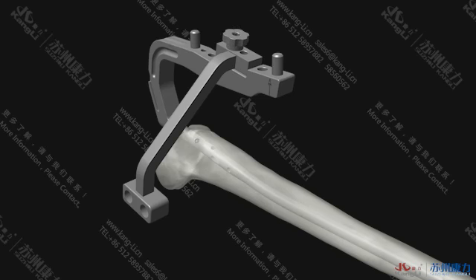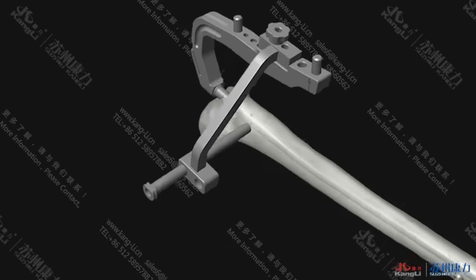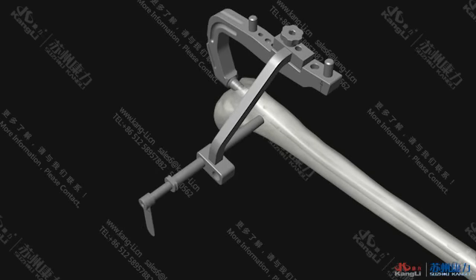Insert the outer sleeve and soft tissue separator into the locking hole of the proximal targeting bracket. Make a 0.5 cm long incision at the place where the soft tissue separator contacts the soft tissue, and then insert the outer sleeve and soft tissue separator until the bone cortex is reached. Remove the soft tissue separator and insert the phi 4.0 inner sleeve and phi 4.0 drill bit to drill.